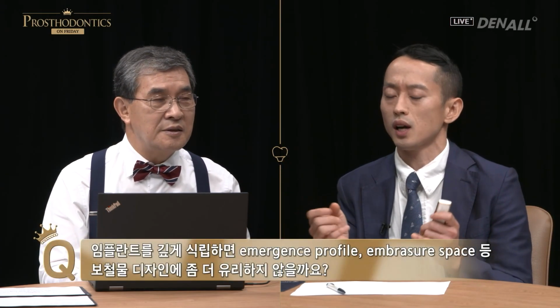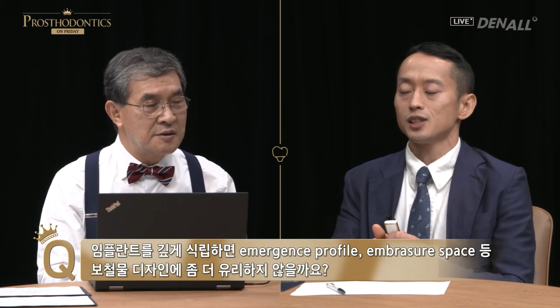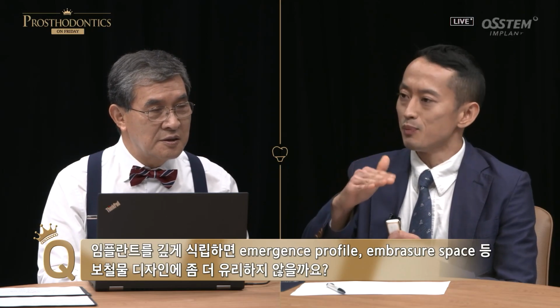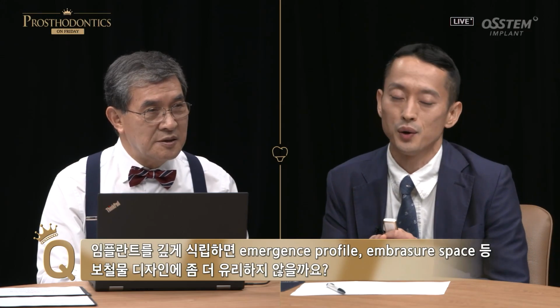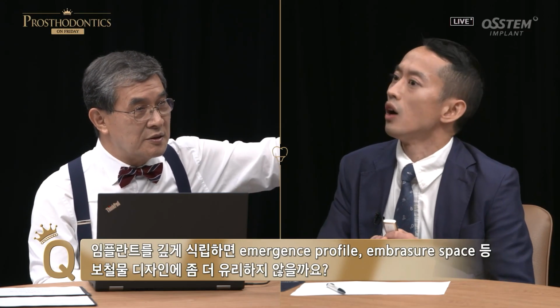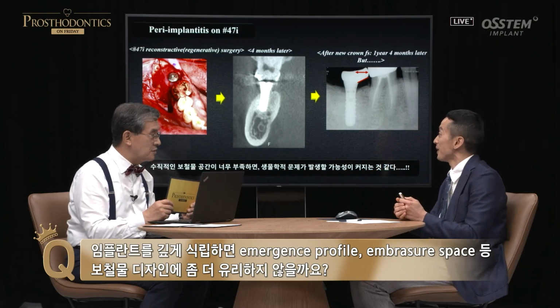I really agree. I agree 1000%. As mentioned, if you place implant deeper, emergence profile angle becomes reduced. Therefore, it reduces stress on the soft tissue and it prevents severe food impaction and prevent emergence angle from becoming too big. It's good in that end. What is best is, before you do implant placement, remove alveolar bone vertically first and place the implant deep. If there is sufficient height, yes. Even if the implant body becomes shorter, that is better.